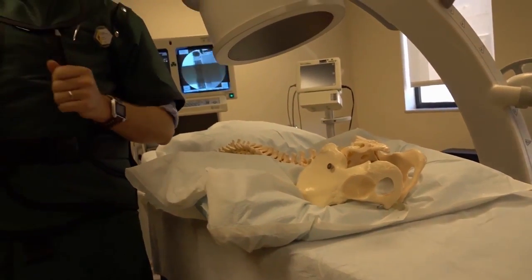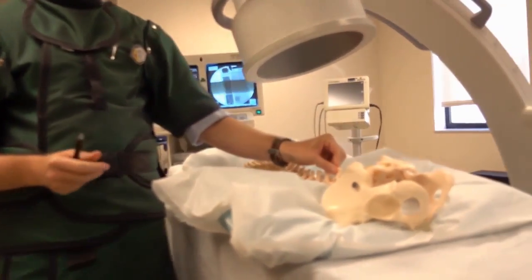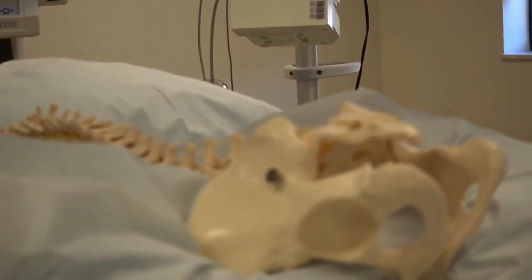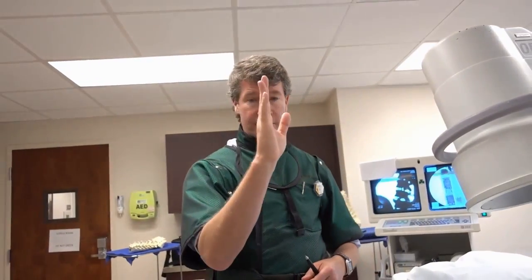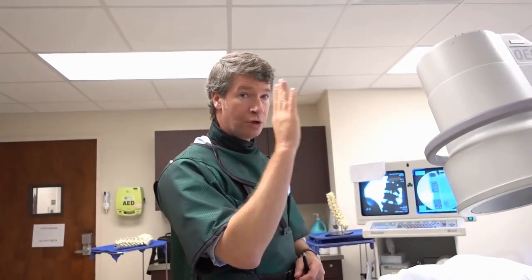It'd be like looking at the fin top down on the dolphin. Okay, and this is the fin of the dolphin. And you can imagine that if you're tilted a little way, it's just like someone's nose. You'll see it tilted and you see more of the nose. If you see more of the nose looking one way, then you know you're not AP. Like this, you see the nose looking right at you, and it's AP. And that's how you know your projection.